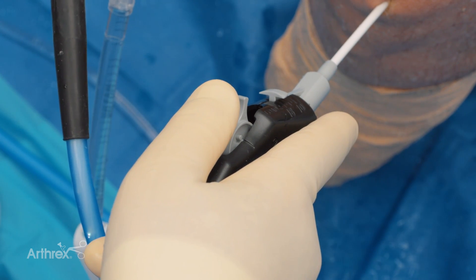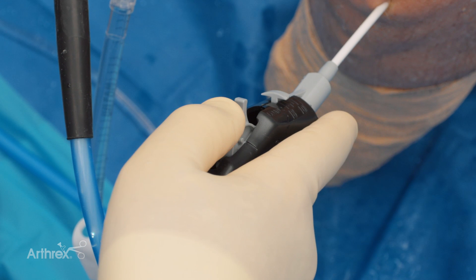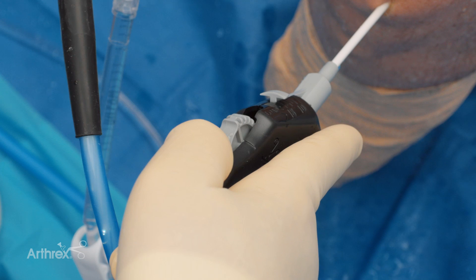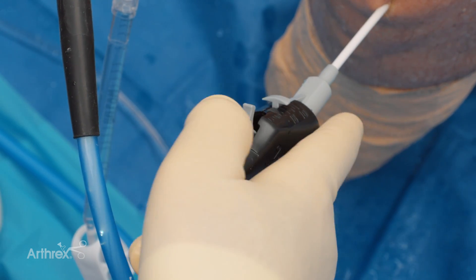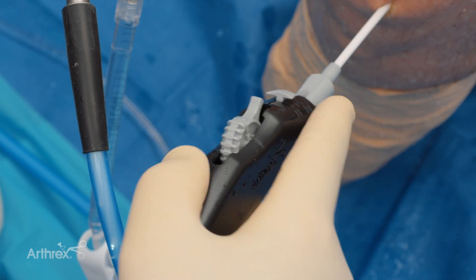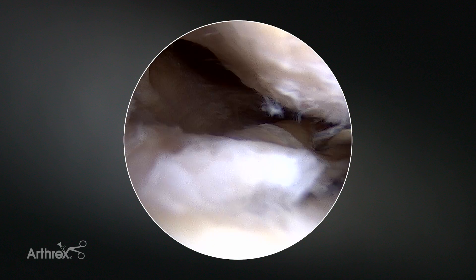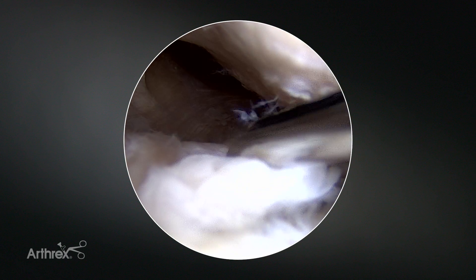To implant the device, as you saw it go in, it's the same as with the fiber stitch before: pull it reverse until you feel it click all the way, and then roll it forward until you feel the same click. And then you disengage the meniscus much better. Then we'll move over to the other side of the tear.